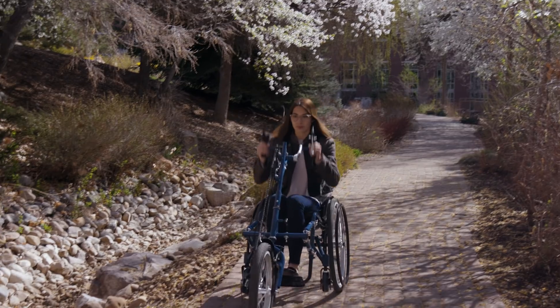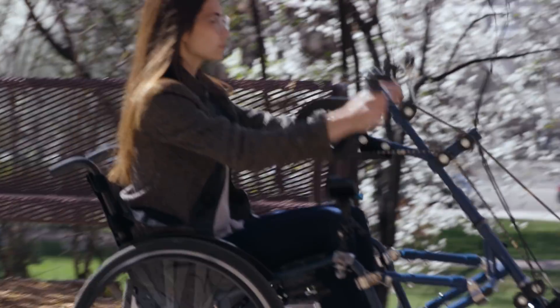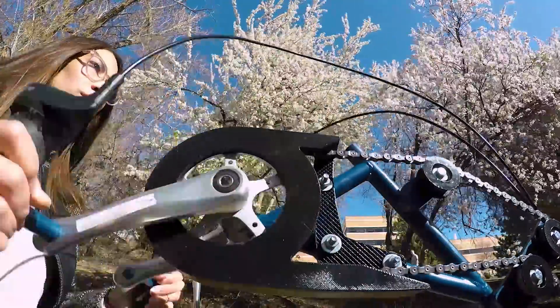It allows the user to pedal continuously at chest level instead of using the wheels on the wheelchair down by their knees. The motion from pedaling the trike is going to be a lot better than pushing forward on your wheels as you normally do in everyday life — it gives you a completely different motion.